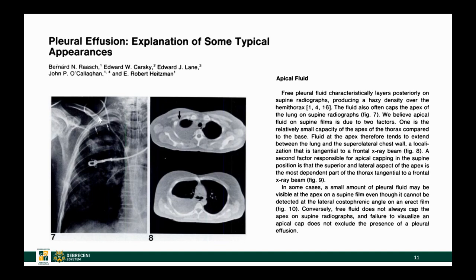The fluid is only visible in the apical region, and again it has to do with the fact that relatively there is much more fluid in the apical region versus the basal areas. Down in the basal areas, there is a lot of lung causing transparency or darkness on the image, versus the apical area where you have just a tiny amount of aerated lung tissue and a lot of fluid. So the easiest place to pick up a tiny amount of pleural effusion on the supine image is either the apical area or along the lateral chest wall.